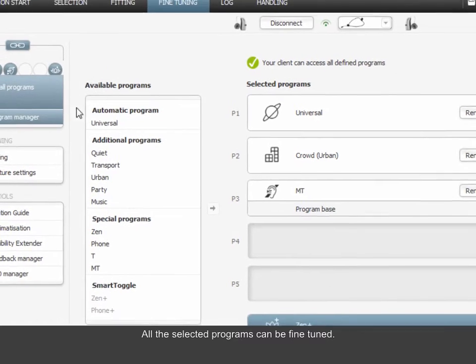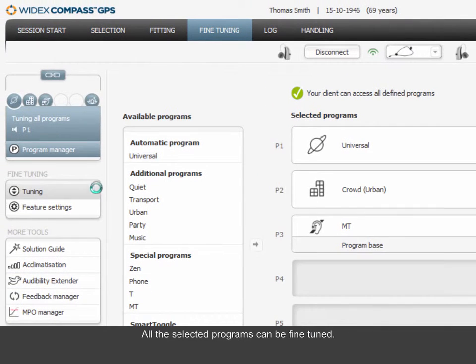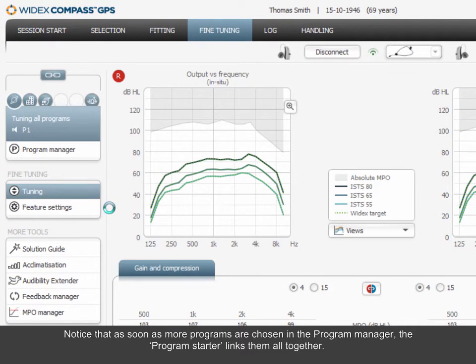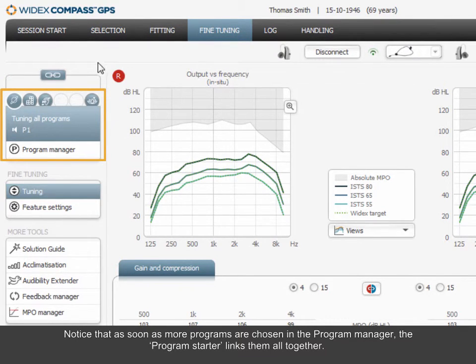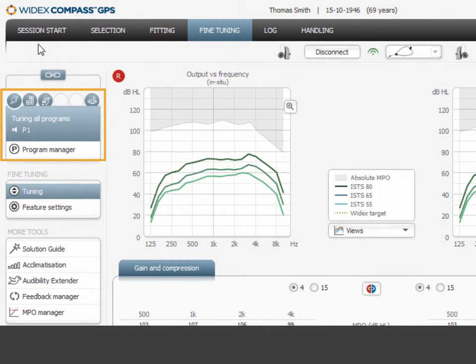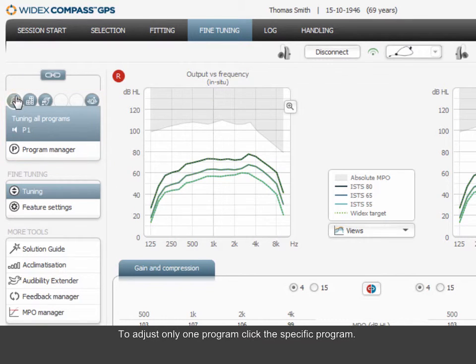All the selected programs can be fine-tuned. Notice that as soon as more programs are chosen in the Program Manager, the program starter links them all together. To adjust only one program, click the specific program.